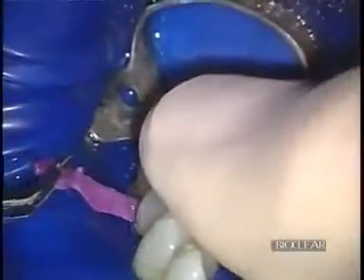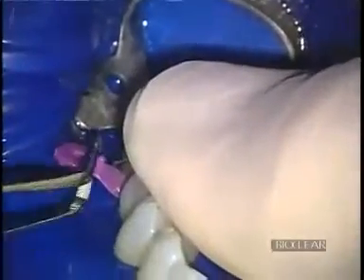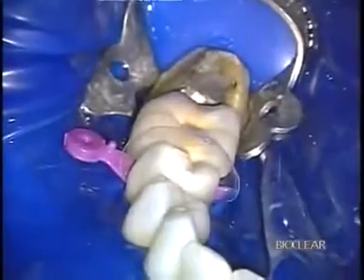Here I am modifying a hollow wedge to reduce the chance of creating a flat spot on the matrix. In the near future, Bioclear will have superior wedges and separators for these difficult cases, but for now these will work very well.